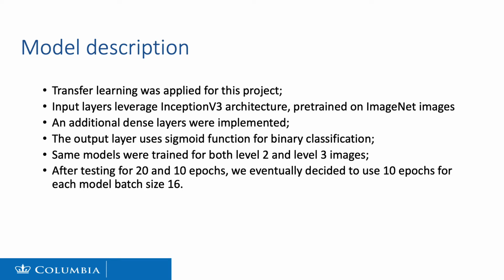In this project, we use transfer learning, and we use the Inception v3 architecture pre-trained on ImageNet images. We added an additional dense layer after the pre-trained model, and we also applied an output layer that uses a sigmoid function so that we can predict whether a slide is cancerous or not. We did the same modeling for both level 2 and level 3 images.